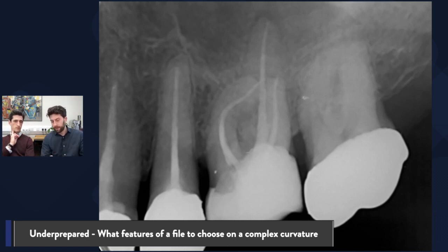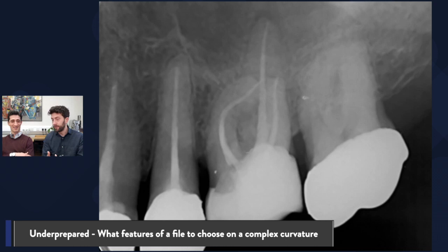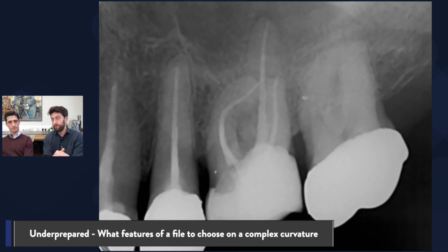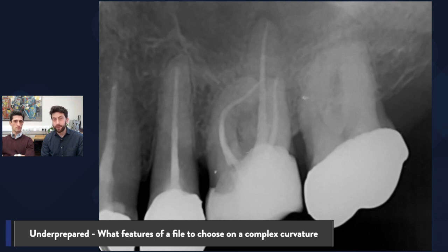So when the file comes out, inspect it — get that little flash of light on the file, discard and go again. I got through two gliders and two Prime files on this because it was such hard work, and I just had the fear I was going to break something because it is a really high tariff case — this is about as high tariff curvature as we have to deal with. That's a very nice result — well done. Hopefully that's been a useful insight into a little bit of our thought process with curvature management. If you've got any other topics you'd like us to discuss, just drop a note in the comments below. Cheers for now.